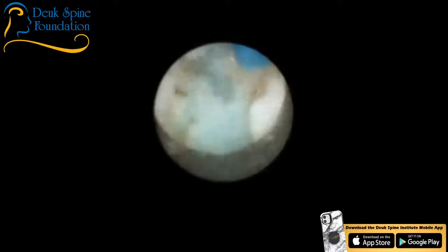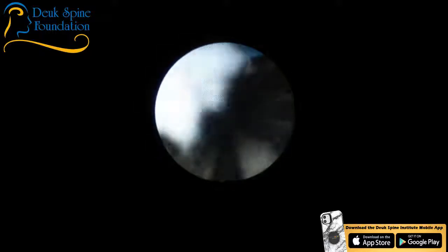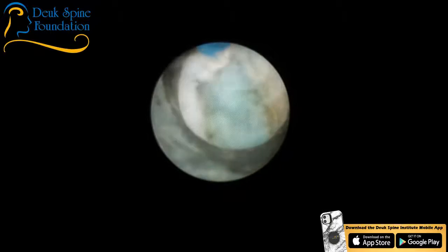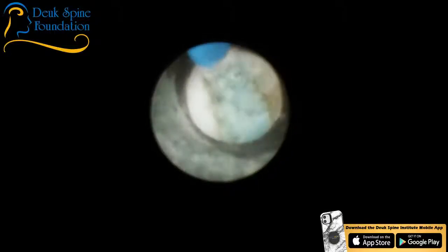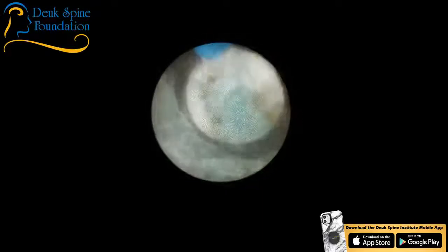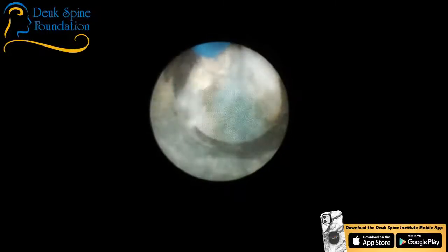There's all foraminal herniation right there, little pieces coming out as I'm releasing them. Those are pushing on the nerve root. This is C6-7, so they'd be pushing on the C7 nerve root. That's the one that goes to your triceps. Okay, triceps, brachioradialis, and triceps. You know, there's always overlapping innervation, but triceps is the main one.